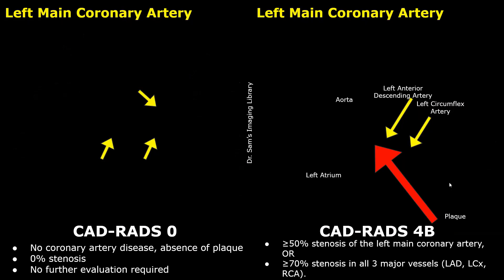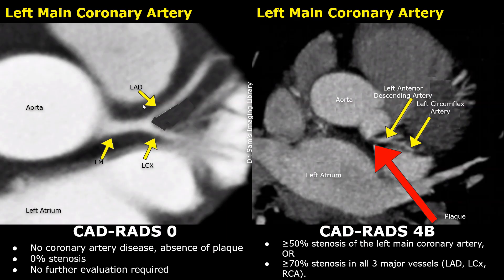These are axial images of the heart focusing on the left main coronary artery. In the normal image, there is no high or low density plaque present in the artery. No stenosis is present, and the enhancement is normal. In the image on the right, a non-calcified plaque is present in the left main coronary artery. The plaque pretty much involves the entire lumen. This case will be classified as CADRADS-4B.